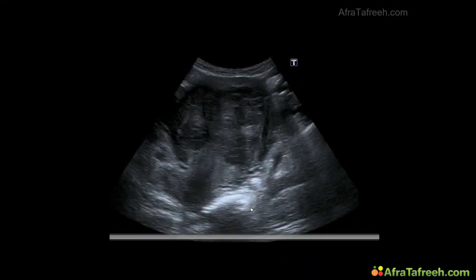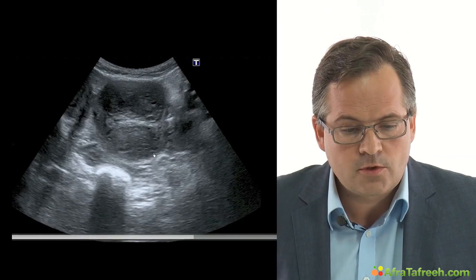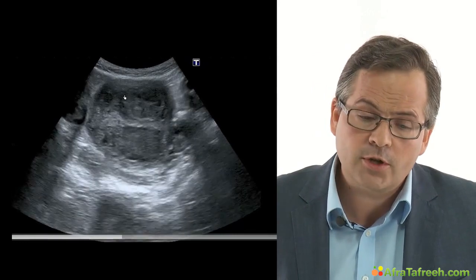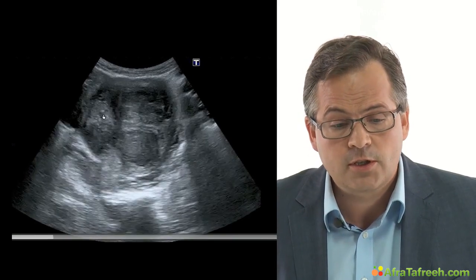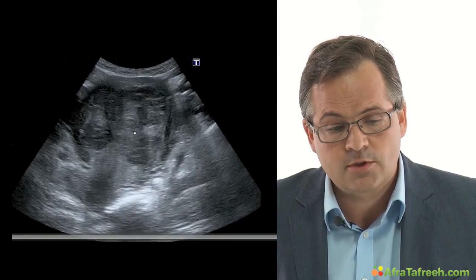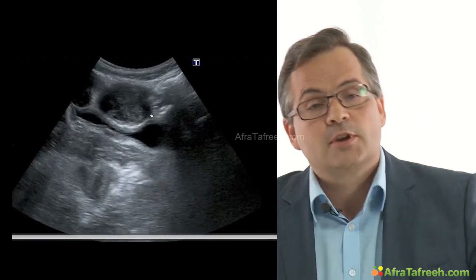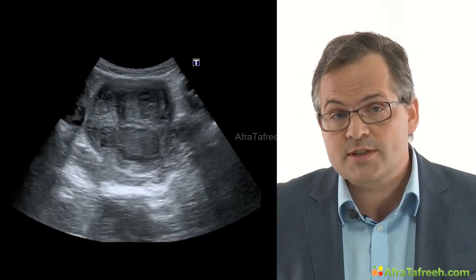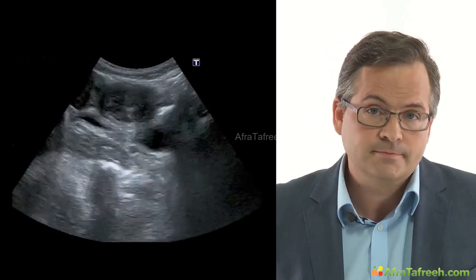The sonographic findings of the myoma we can see over here. There is an enlarged uterus with multiple round-shaped tumors. Some of them are hypoechoic and some of them are more intense, so hyperechoic. And there is an inhomogeneous texture in this one and in this one. So in this case, it can be myoma, but we have to make a repeated examination to check for the size of the tumors. When the tumors are increasing rapidly by the next examination, there also can be a malignancy.